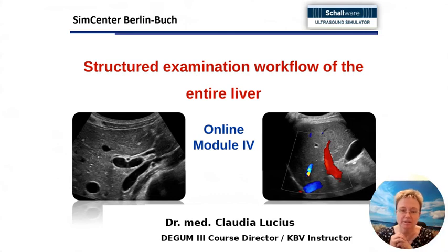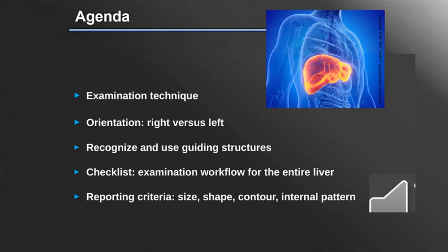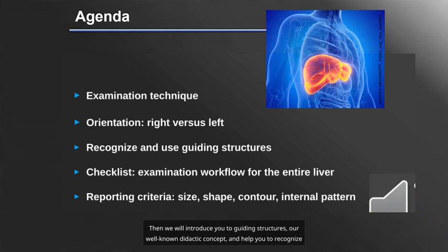How will we proceed? On one hand, it's about fundamental aspects of the examination technique, then quite simply the right-left problem, which is always widely underestimated. Then we will introduce you to guiding structures, our well-known didactic concept, and help you to recognize them in order to finally bring this together in the form of a checklist for an entire examination procedure.